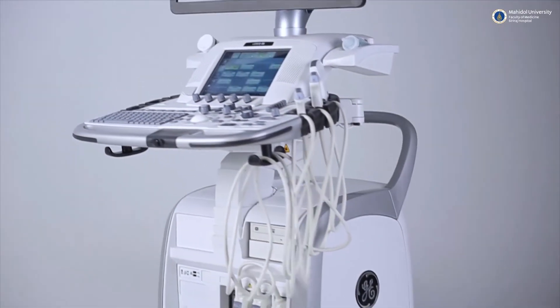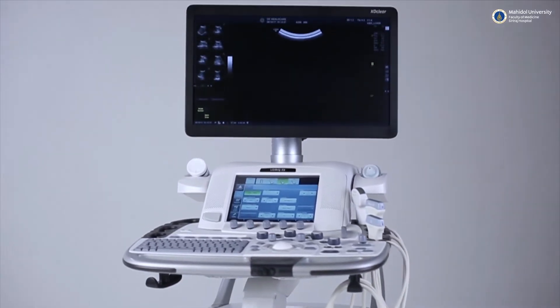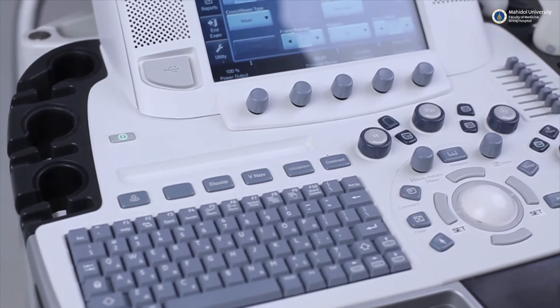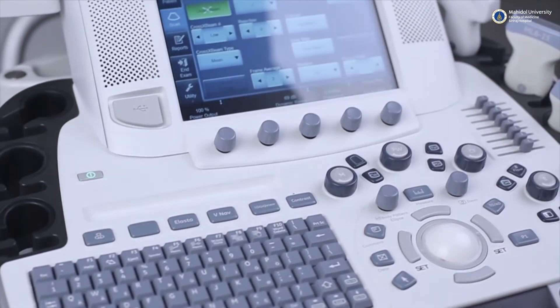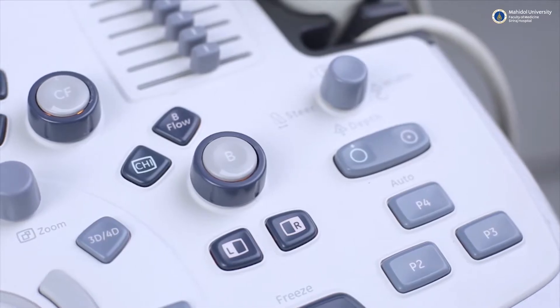Technique for ultrasound examination. Before performing an ultrasound on your patient, you should have an overall understanding of your machine first. Although there are a number of differences between machines from different companies, their principles are generally the same.